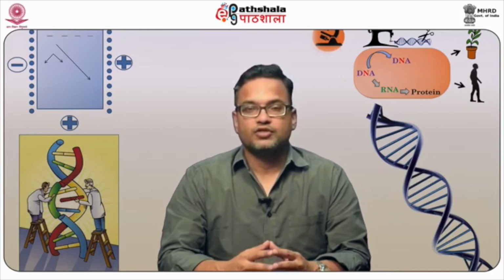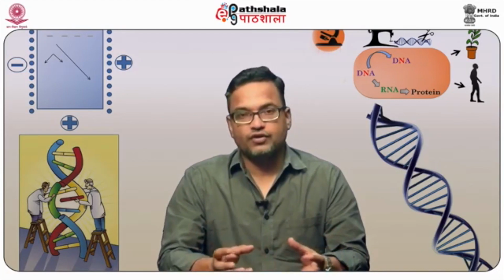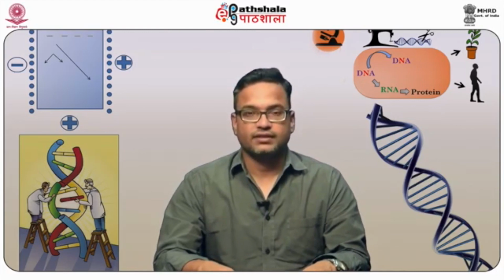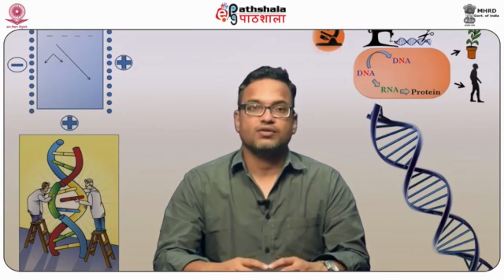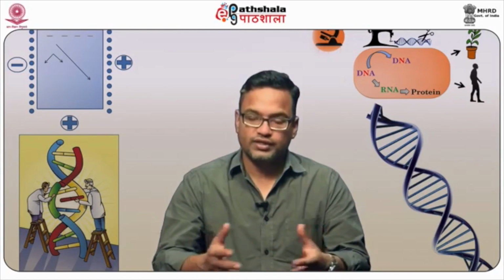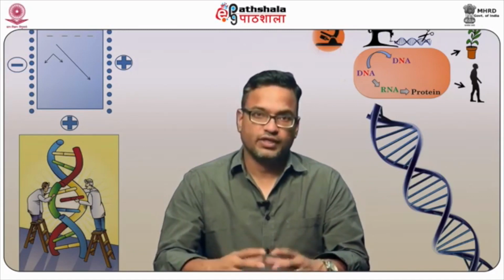Briefly, about how the in situ hybridization technique has evolved over the years: the very initial experiments to visualize the cell membrane, the different organelles within the cell, as well as the cellular structure and subcellular organization, were done using natural or synthetic dyes. These dyes interact with the cellular structure by binding to either protein, nucleic acid, lipid or carbohydrate. Therefore, once you view them under the microscope, you can see the structure of that particular cell at that moment, as well as its subcellular organization.